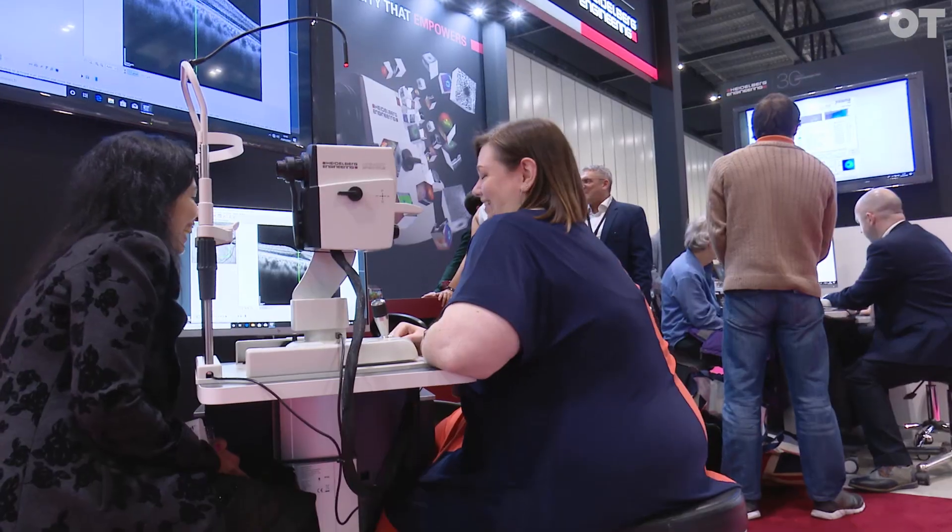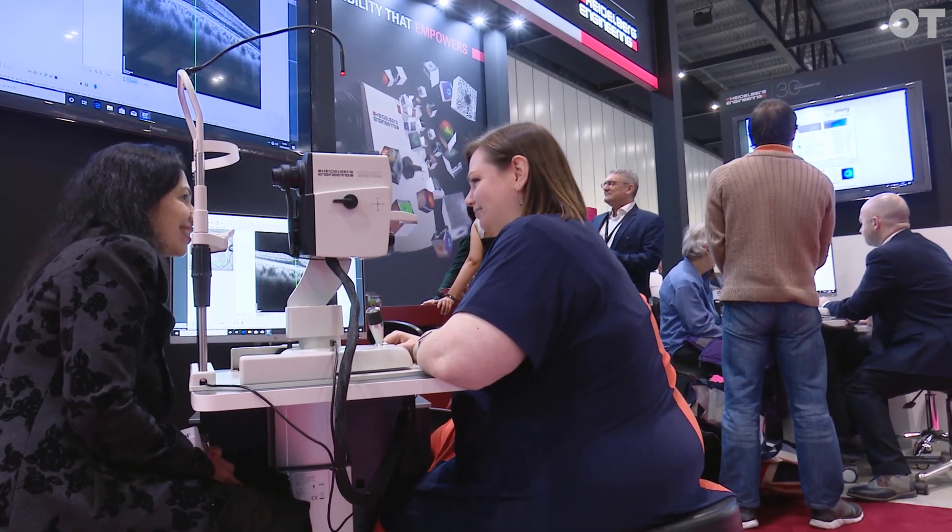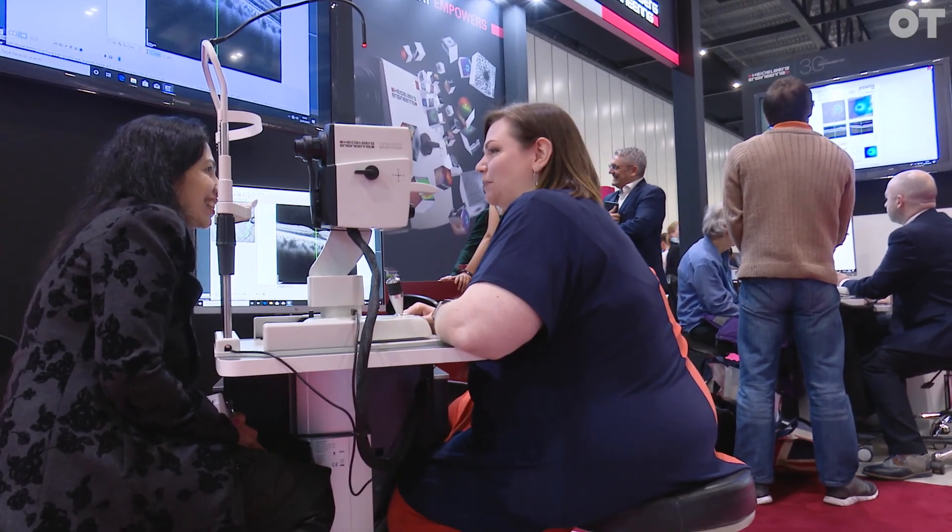It's a huge new part of the glaucoma story, which really ties our whole analysis together — now because we scan the optic nerve head and the full macula for signs of glaucoma. We're in the process of upgrading a lot of our existing customers who have the GMP module, which stands for Glaucoma Module Premium Edition. All those existing customers are eligible for this upgrade free of charge, and we're rolling that out at the moment. The initial feedback has been fantastic.